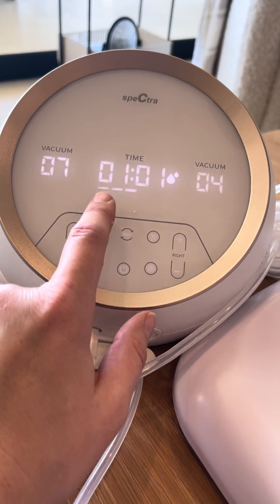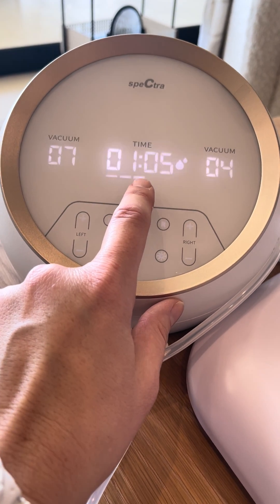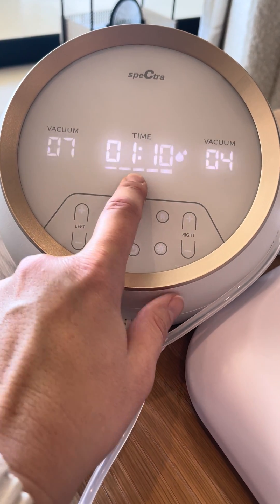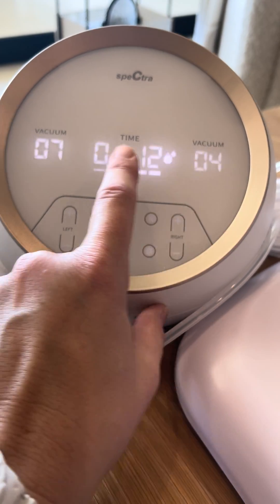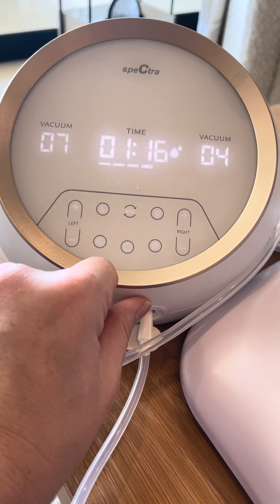This is also going to control how fast. This button — you'll see the bars — is how fast. So this is how hard, and this is how fast. This will change it slower or faster.